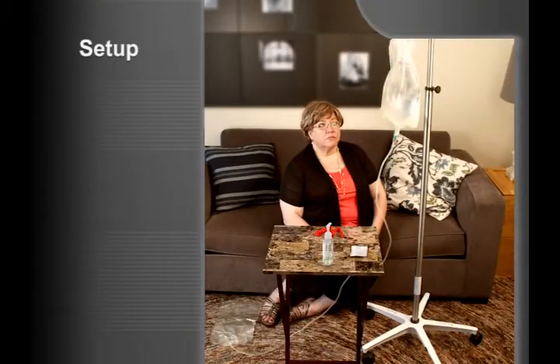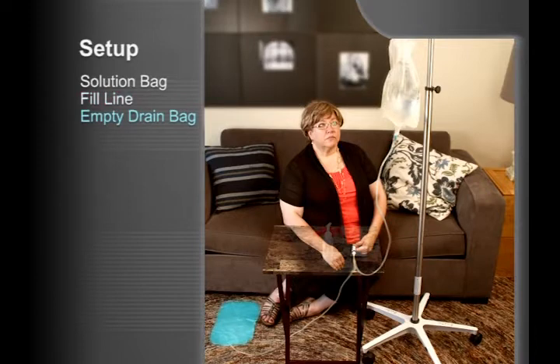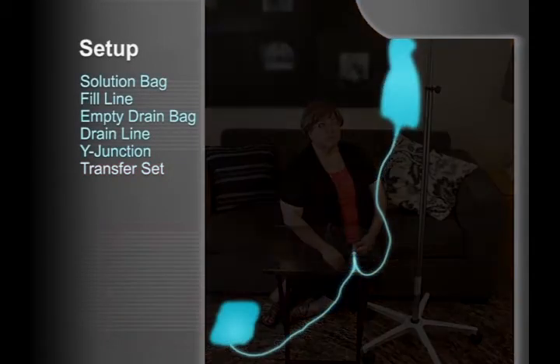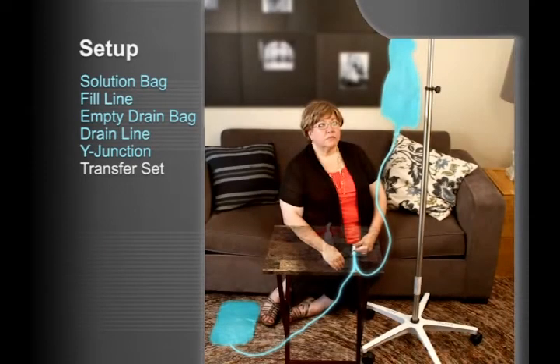Let's start with the main components of the UltraBag system. The six main parts are the solution bag, the fill line, the empty drain bag, the drain line, the Y-junction with the patient connector that attaches to the transfer set which is connected to your catheter, and the transfer set. As you can see, the solution, the fill and drain lines, the patient connector, and the drain bag are already attached to form one complete unit.